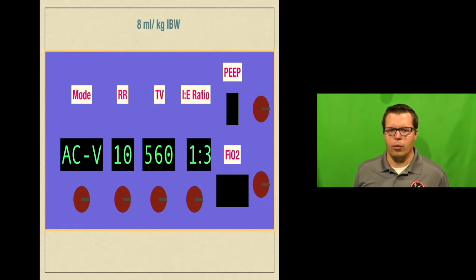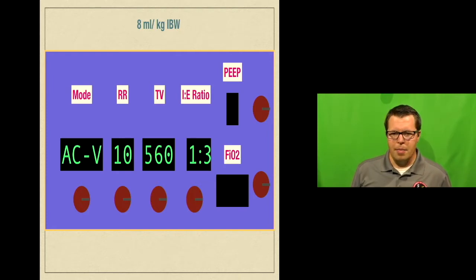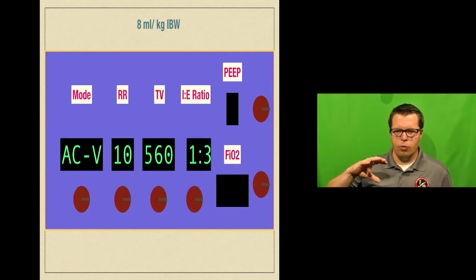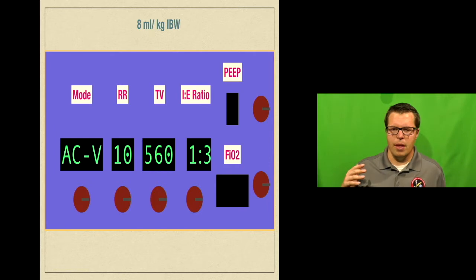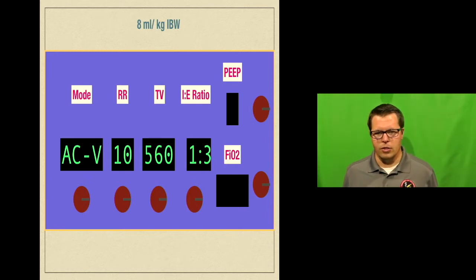If you don't have a graphic readout on your portable ventilator, on your EMS ventilator, the sort of poor man's way to do that may be to put your stethoscope on their chest, get it really quiet so you can really hear, and then listen for the wheezing to stop on their expiratory phase. If they're clearly getting a breath while they continue to wheeze, then they probably haven't completely emptied their lungs, and you may need to stretch out that I:E ratio. It's not perfect. It's not 100%. It's not as sophisticated as the flow charts on the actual ventilators themselves, if you have it available, but most of us don't have that available. So it's something you can do if you have nothing else to use.